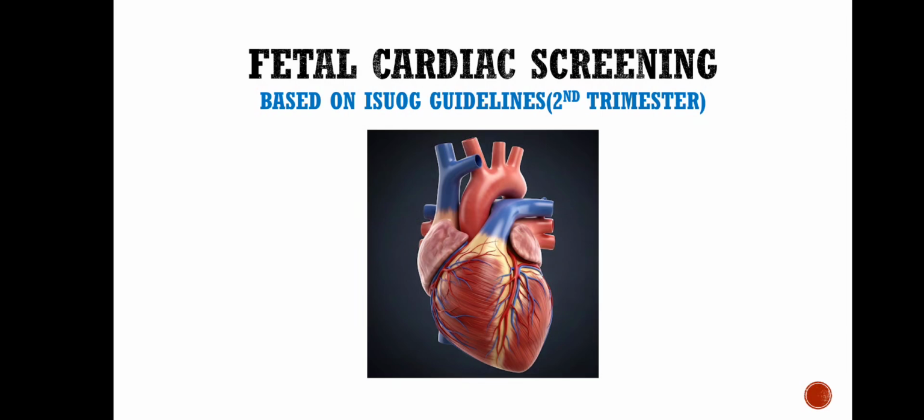Why fetal cardiac screening? Congenital heart disease affects approximately 8 to 10 babies per 1000 live births and contributes significantly to neonatal morbidity and mortality. Early prenatal detection allows better parental counseling, appropriate planning of delivery, timely neonatal intervention, and improved outcomes. Therefore, every anomaly scan should include a complete and structured cardiac screening examination.